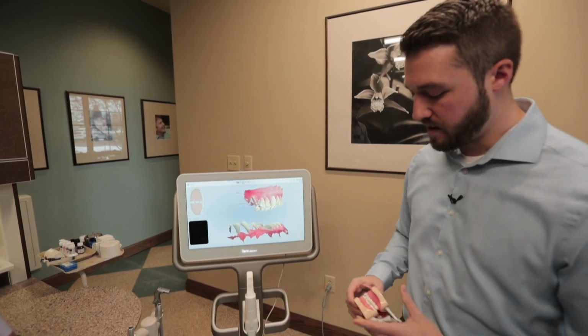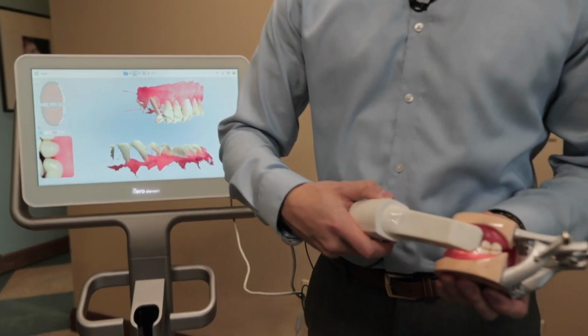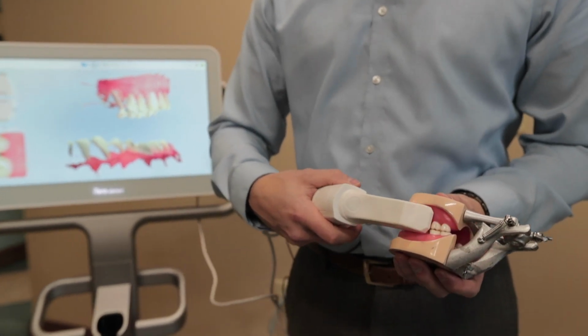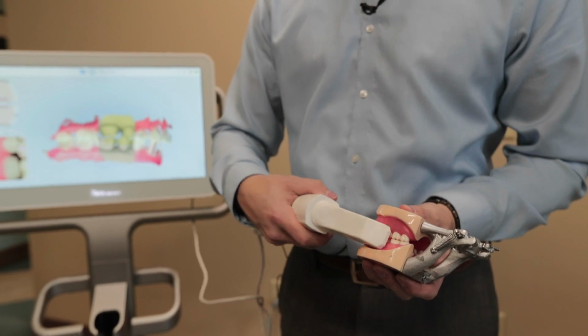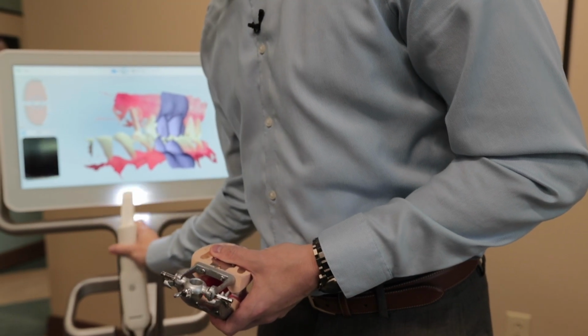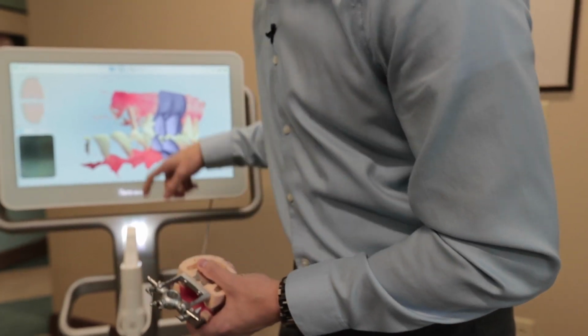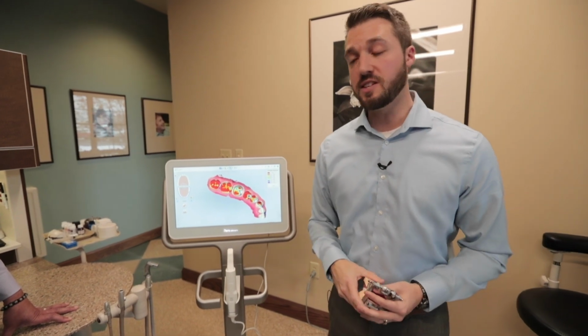All right, we're going to have the patient go ahead and go into full occlusion. We're going to stick the wand in right on the side. We're going to turn it on and we're just going to simply move it up and down. What's going to happen on the scanner is you're going to see it just locks into the tooth. It turns purple, it means we're good to go. And now what we're going to do is hit our button up here, which is called post-processing, and that allows us to process and bring every scan together.